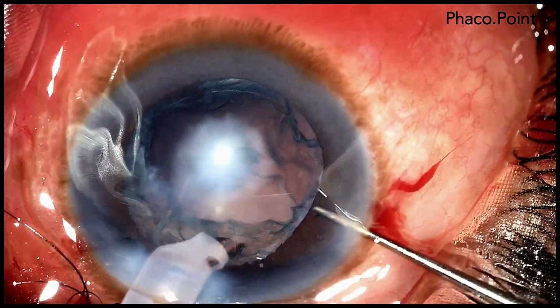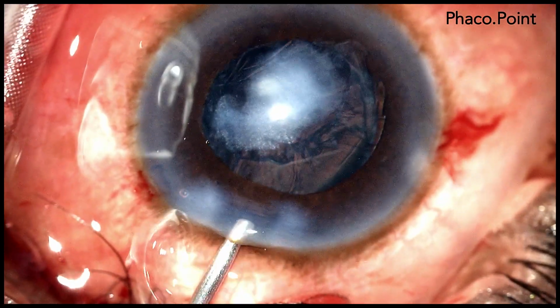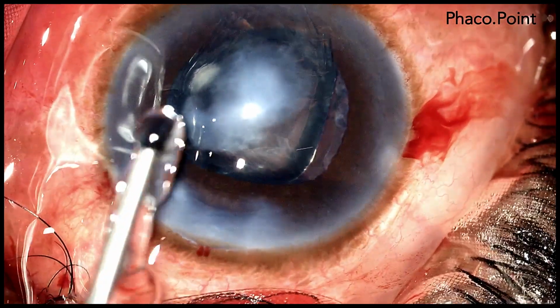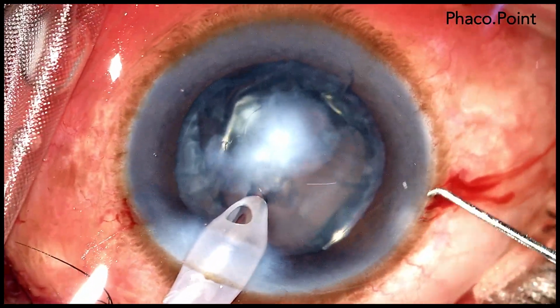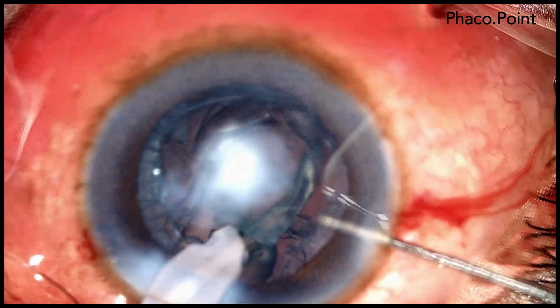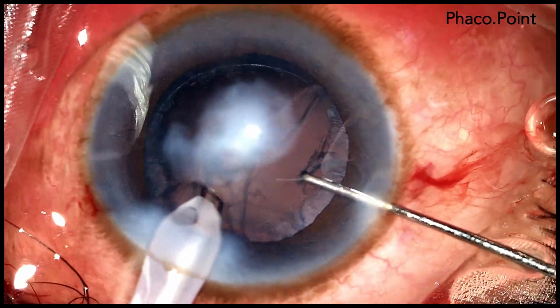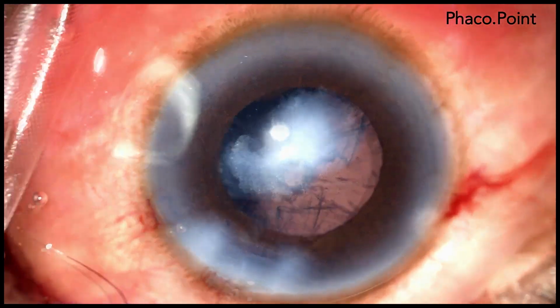Next, we attempt to remove the epinucleus with the epinucleus mode of the Phaco. As you can see, I perform a viscodissection on the right side with the view of attempting to prolapse the epinucleus inwards, and having been successful in doing so, once more I introduce a Phaco probe in the eye, and in the epinucleus mode, I am able to successfully aspirate the epinucleus.